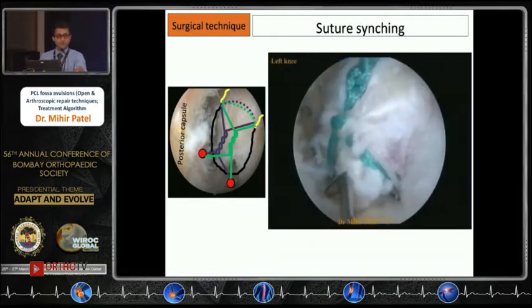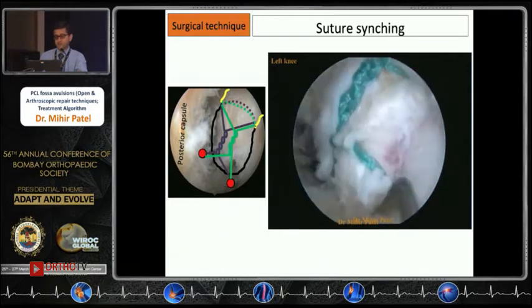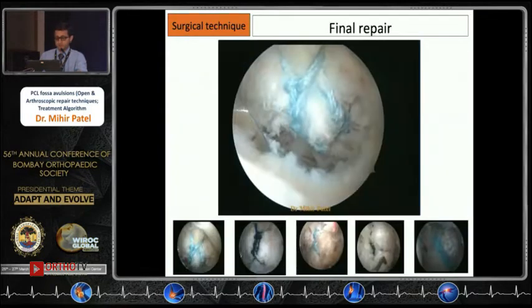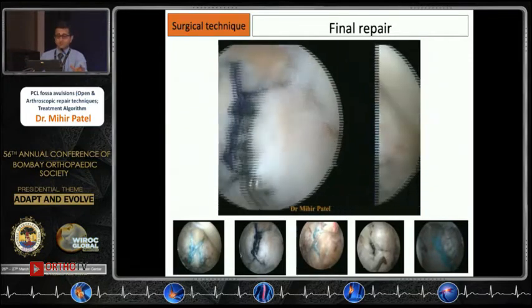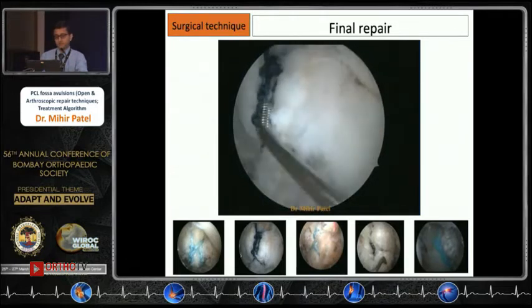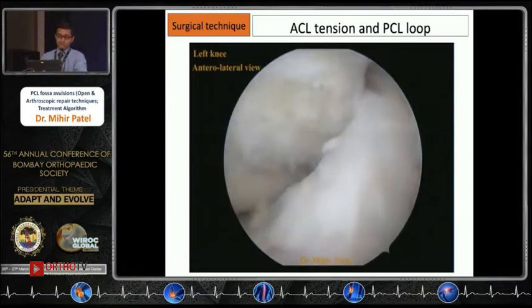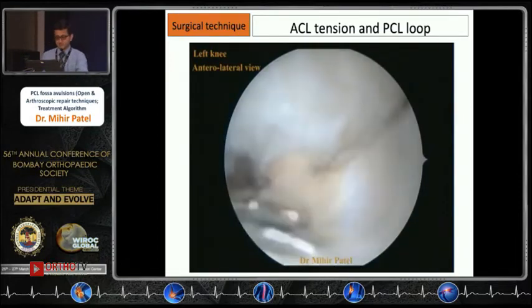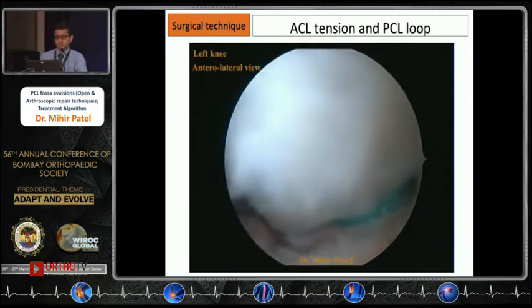The sutures are tied on a bone bridge anteriorly, and as we tighten them the fragment falls back into its fracture crater. That is the final product — two suture bridges posterior to the knee pressing the fragment into the fracture crater for very robust fixation. In the anterior compartment, the ACL is now nice and taut because the tibial sag has been corrected, and you can see the fibers looped at the junction of the PCL ligament and the bony fragment.